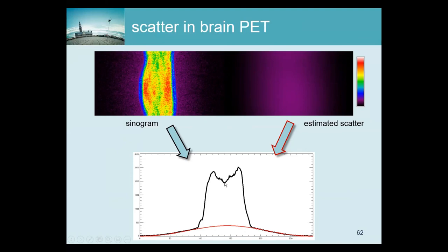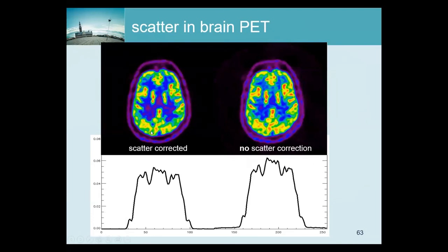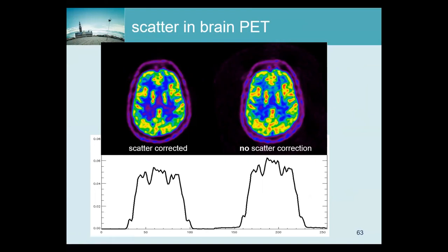In scans of the thorax and the abdomen, the scatter contribution is relatively large and even, so you definitely need to correct for quantification. Visually it's not too bad — this image has been reconstructed correcting for scatter, and here is one without scatter correction. They look similar, although you see the activity is a bit higher without correction. If you draw a profile it's significantly higher. But if you want to do tracer kinetic modeling and quantify the metabolism, you definitely need to correct for scatter because this overestimation of activity will lead to an overestimation of the metabolism.